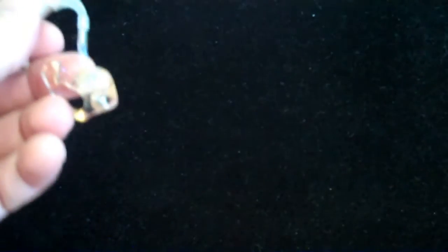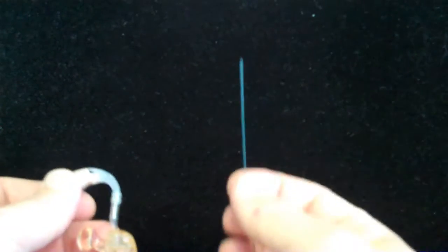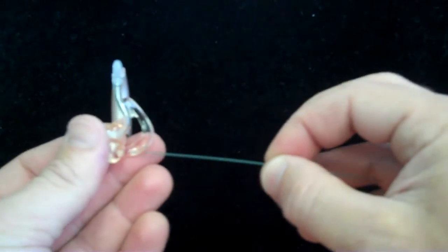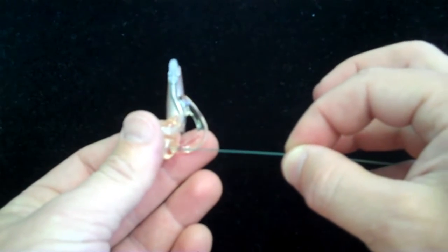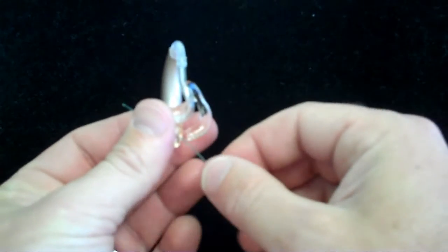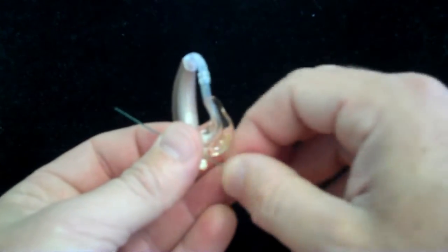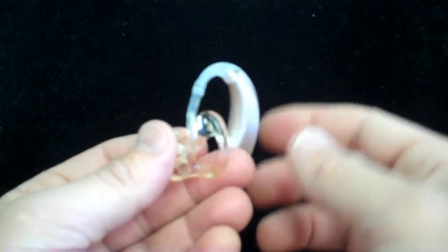A second thing you may want to consider here is running something similar to this monofilament through the air passageways to ensure that it's unplugged. And if you'll watch this, from the outside, I'll push that right through the air passageway, and it pokes through without any problems, indicating that the passage is open and air can bypass very easily.